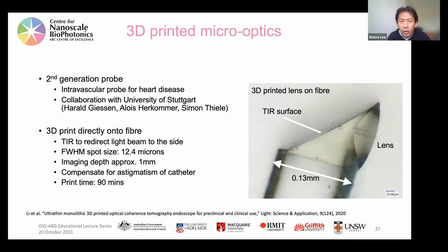Cool. There's a question in the audience. Evanesh asked, is it always advantageous to use a side-facing lens in different biological environments? It really does depend on your application. Making a forward-facing lens is a bit easier, because you don't have to have some sort of mirror mechanism on the front. And there are times when that's useful. So we made some needle probes for insertion, where the idea was that as you inserted the needle forward, you wanted to know before you hit a blood vessel.